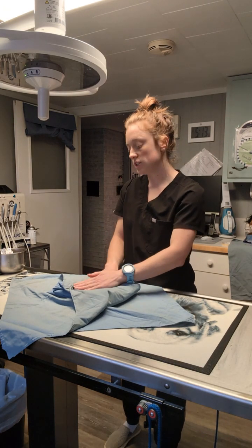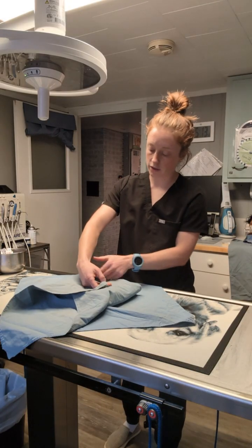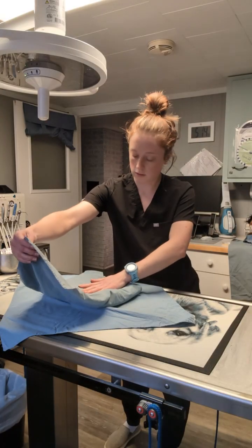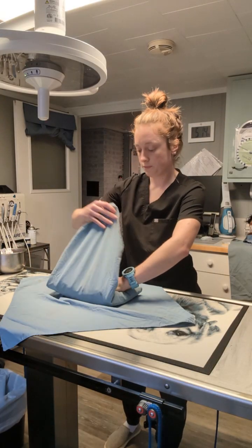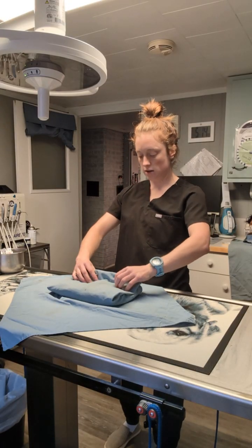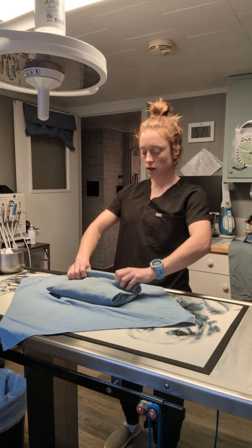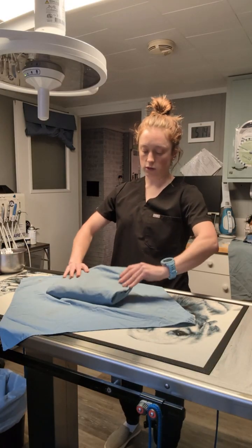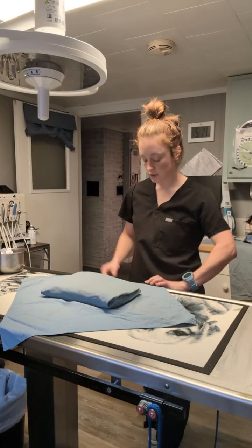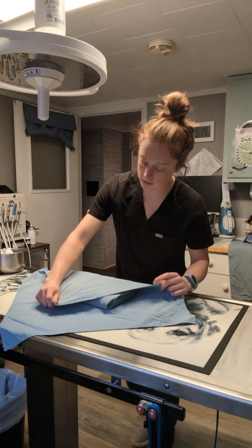And then I'll fold over each side, again folding back the corner afterwards. And lastly, folding the last side and tucking it in so that there is a little triangle sticking out. And then I will just repeat that process.